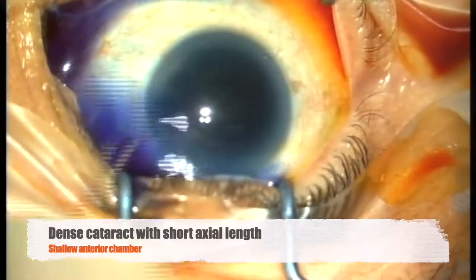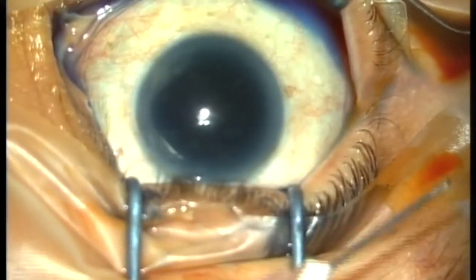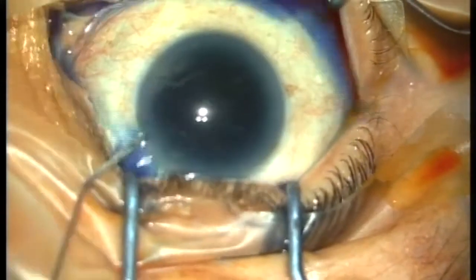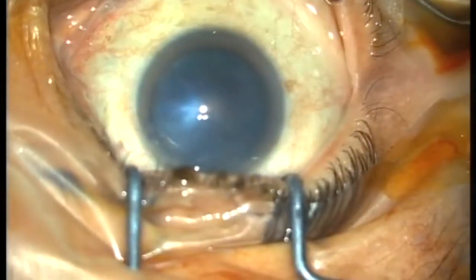The cataract was brunescent. At the same time, the eyeball axial length was only 22 mm. With a bulky hard cataract, another challenge was to deal with the shallow anterior chamber. I start with creating a paracentesis, filling up the chamber with VisionBlue and washing it off with intracameral lignocaine.